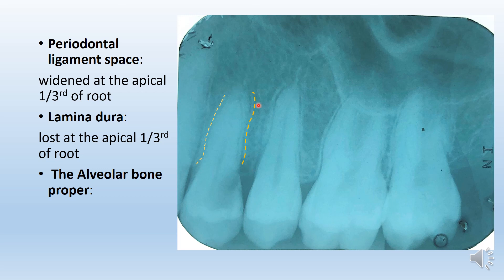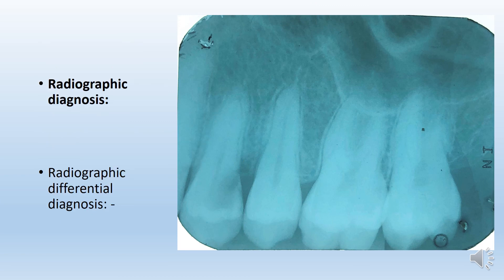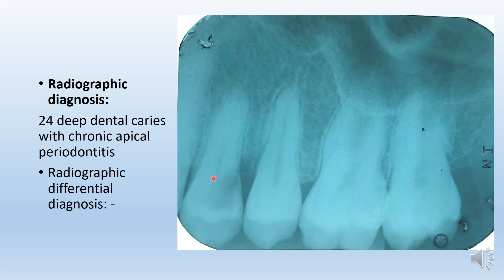Looking closer, these are the normal trabecular appearances at the maxillary premolar apex region, and hence the alveolar bone proper appears relatively normal. Since we have seen widening of the PDL space, loss of lamina dura at the apex, and a well-defined radiolucency consistent with dental caries involving the pulp — they all correlate. The radiographic diagnosis is: Tooth 2.4 — deep dental caries with chronic periapical periodontitis. Always start with the tooth number, followed by the finding and then the diagnosis.